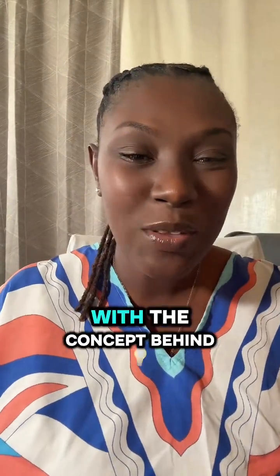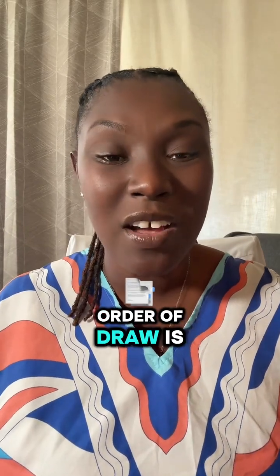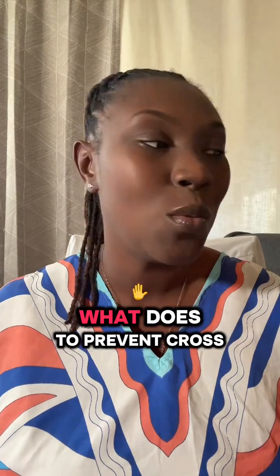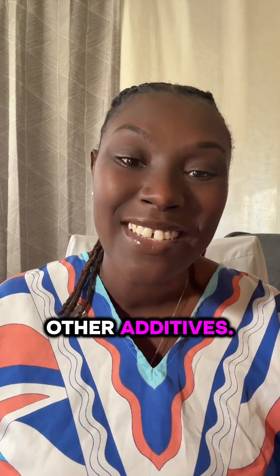Now, let's start off with the concept behind the order of draw. What is the purpose of the order of draw? The purpose of the order of draw is to prevent cross contamination. Okay? What does that mean? What does to prevent cross contamination mean? It means that some additives can mix with the other additives.